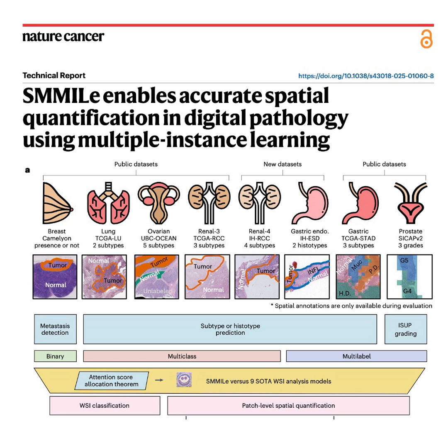It does. Because IML is so intensely focused on finding the defining feature of the bag, it produces these highly skewed attention maps. Skewed how? Well, it gets completely obsessed with the most obvious, highly discriminative cancer cells. It assigns them massive attention scores and practically ignores the subtle, low discriminative cancer cells. So in data terms, it suffers from incredibly low recall.